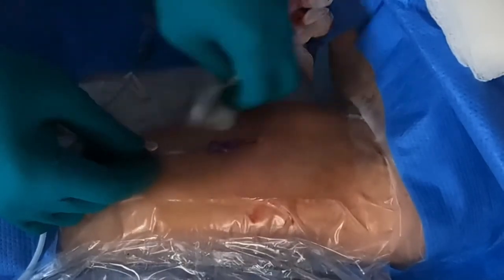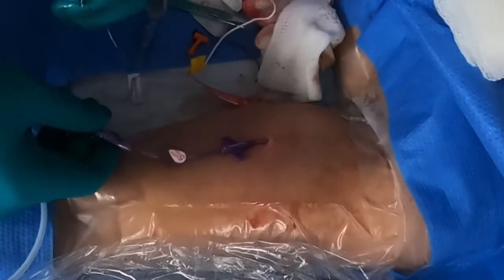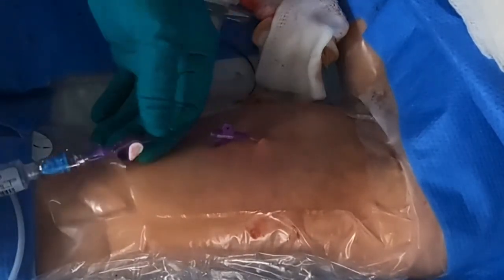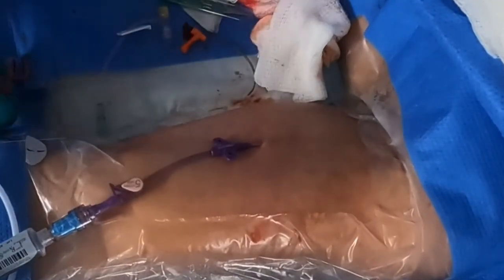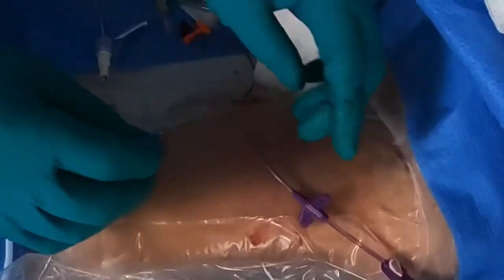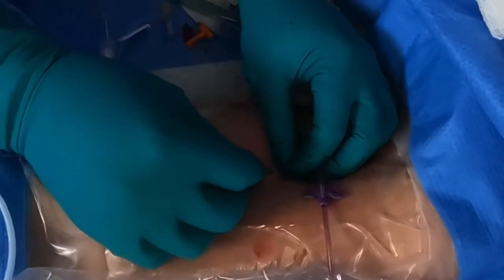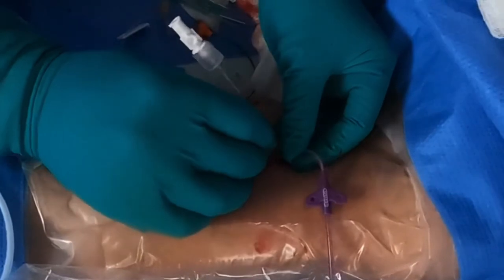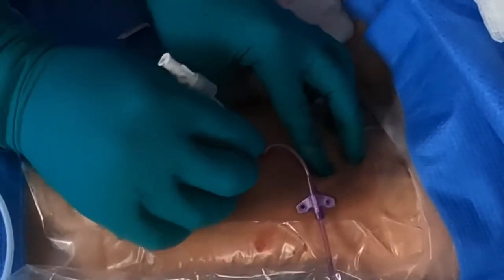You didn't even feel it? No — I didn't know you put it in that far! Look at that testimony — that's what good numbing does. Good blood return, good flow — awesome. We're going to add the secure cath on now. Also, reason why I put a big intradermal wheal — so you won't feel this part either. I like to make sure my patients feel nothing. Nice and dry — not slick from the gel.